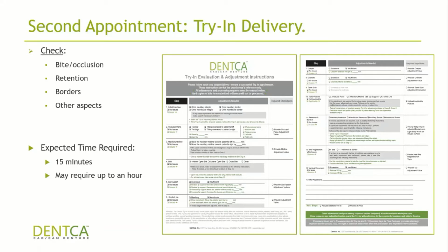Many people ask me, well, how long should I book the appointment for these patients? And basically, it all depends. So if you did a pretty good job during your impression session, there is no reason why this appointment should last more than 15 minutes. Basically, you should be able to insert those dentures almost right away without any areas impinging the patient. If you need to make adjustments, they should be very mild. And then you should be able to evaluate everything else and then move on.